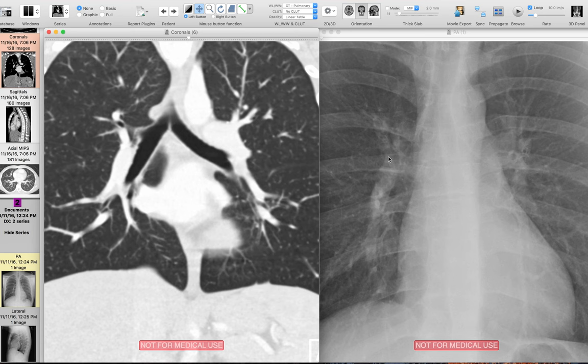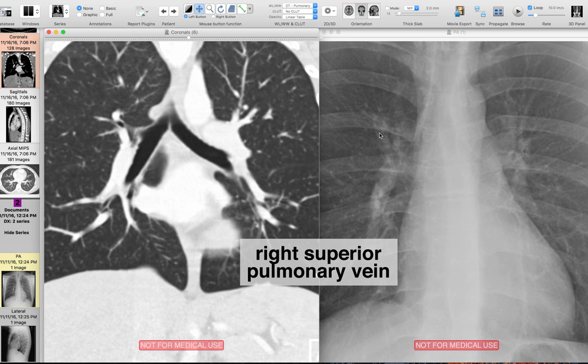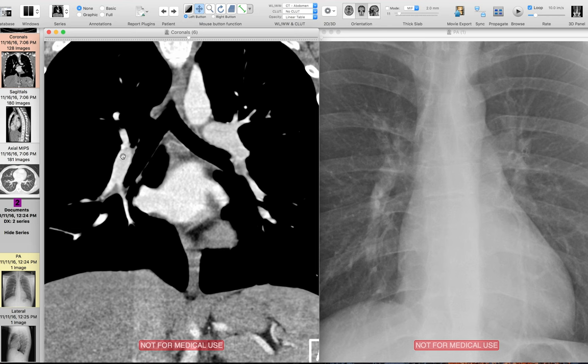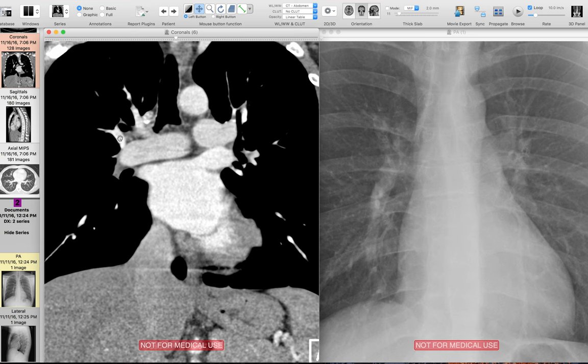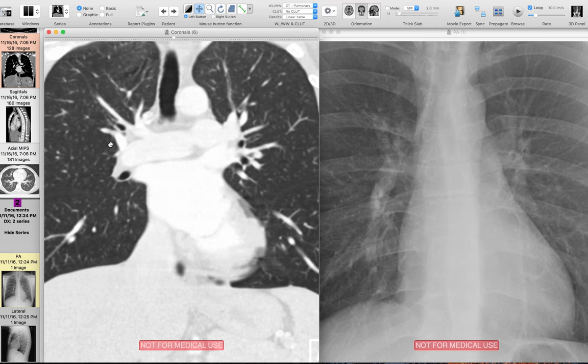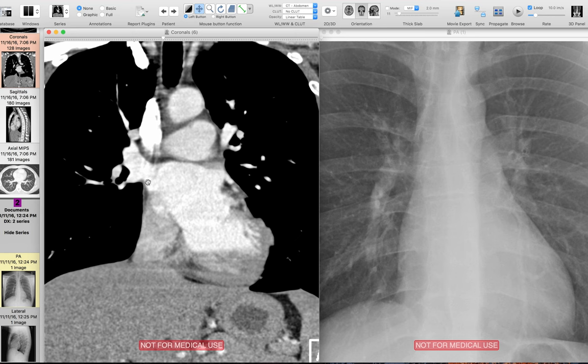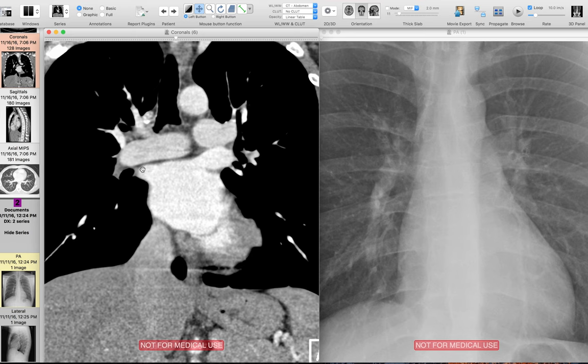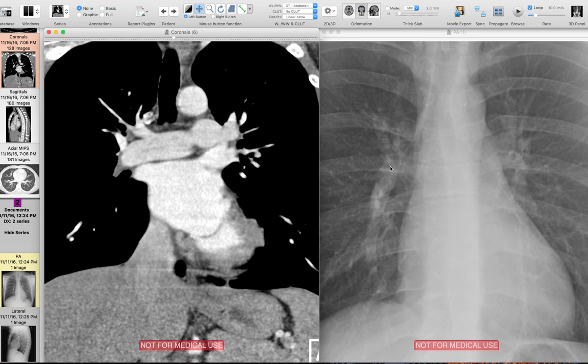The superior part of this boomerang shape is the right superior pulmonary vein. Going back to the CT, we can identify this structure — the right superior pulmonary vein — which again is right next to normal lung, and that's why we can see it on chest x-ray. Tracing it back, it leads to the ostium of the right superior pulmonary vein and into the left atrium. These two structures make up the outermost part of the boomerang shape — the right interlobar pulmonary artery and the right superior pulmonary vein — and the angle they form is called the right hilar angle, which should normally appear as a nice little divot in the hilum.